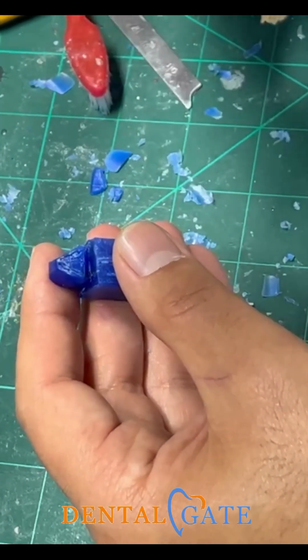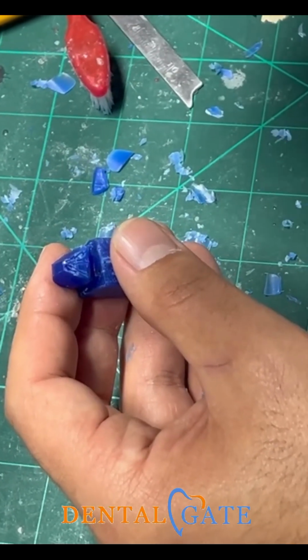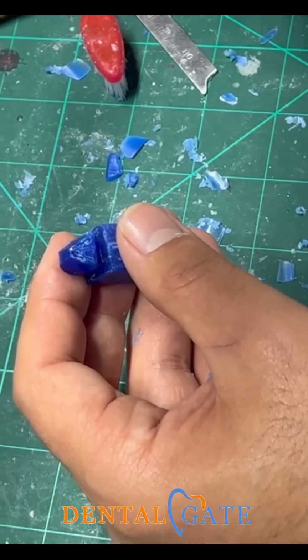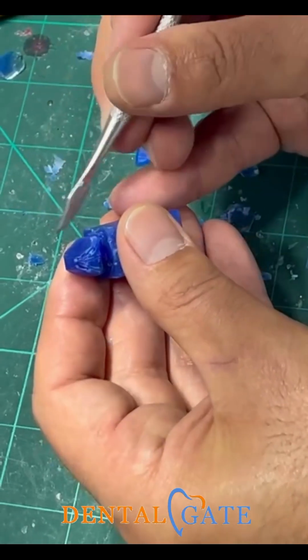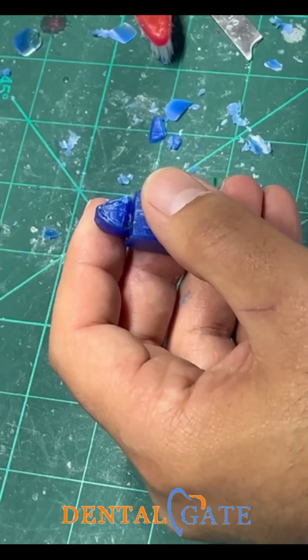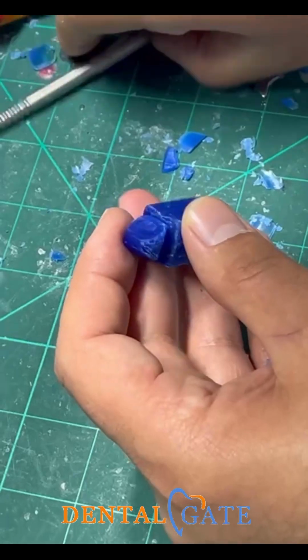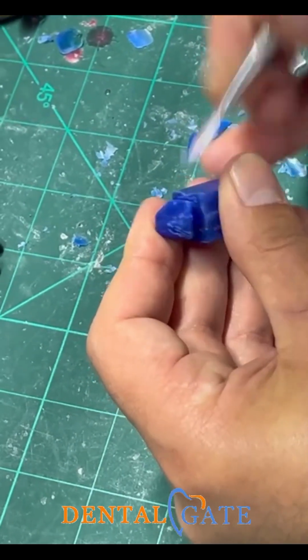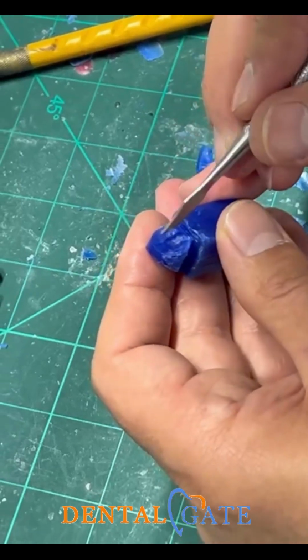That means the initial point to start the convexity will start from here. This is 5 millimeter. So I will make accommodation with the gingival third. So you can remove the excess of wax from the lingual.